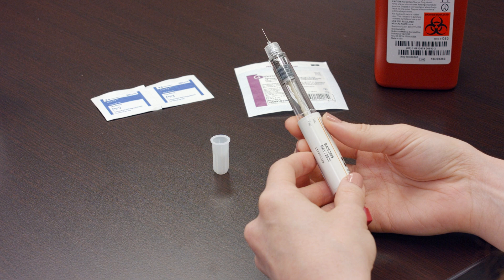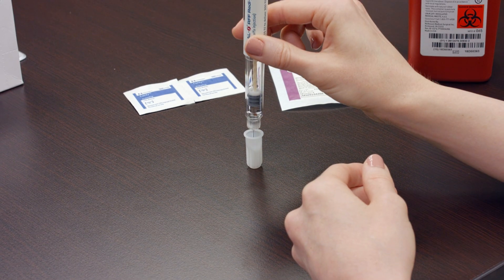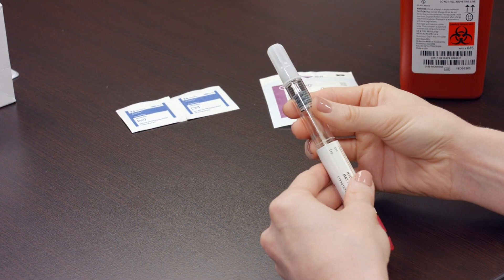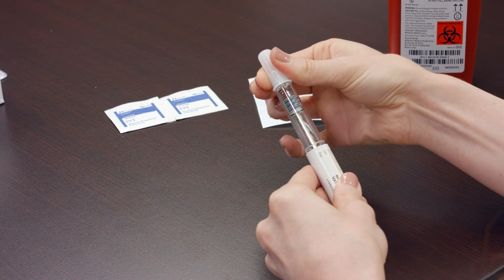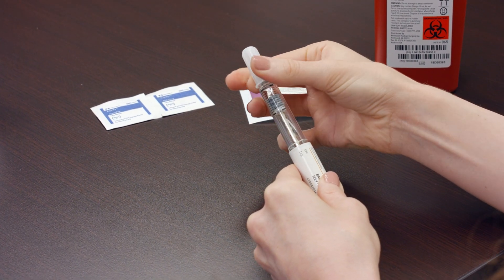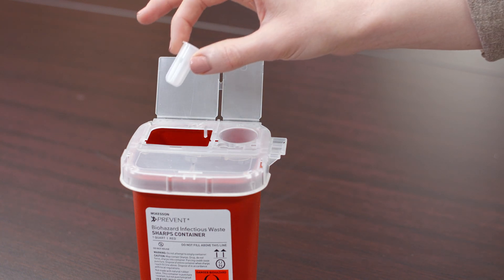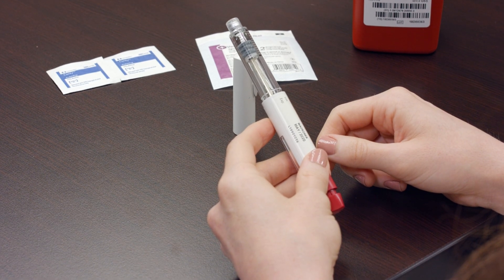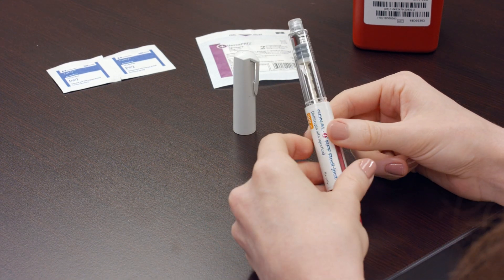Place the outer cap of the needle from before on a flat surface. Do not hold the cap in place or you will risk puncturing your finger. Place the needle into the cap with enough pressure that the lid does not fall off. Once the lid is firmly on the needle, unscrew the needle and cap from the pen. Place the needle into your sharps container. If there is no medication left in the pen, dispose of the empty pen.